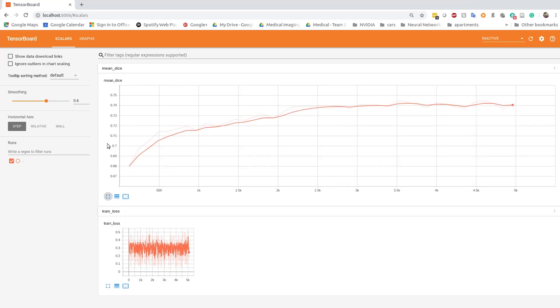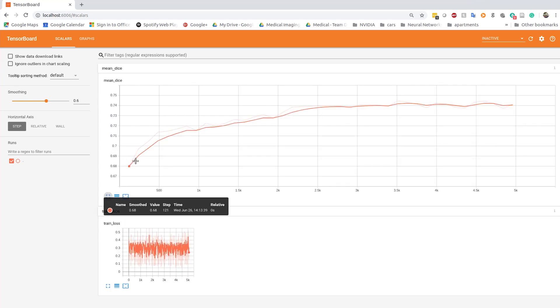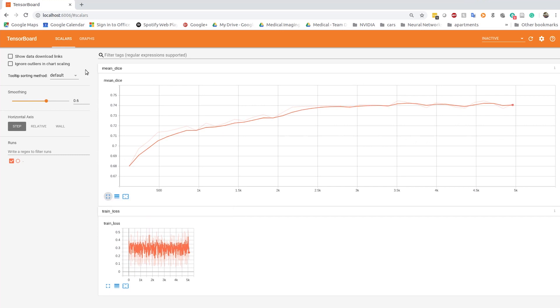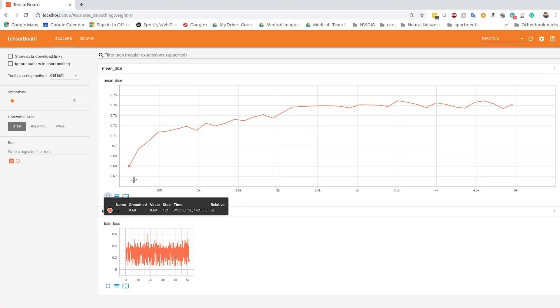Using TensorBoard, you can monitor as the model adapts to the newly annotated data. Transfer learning is a great way to accelerate the creation of AI models using less time and less training data. In fact, we were able to achieve target accuracy for this model with one-fourth the data and time required as compared to training from scratch.